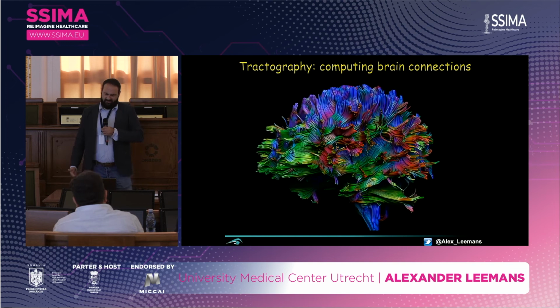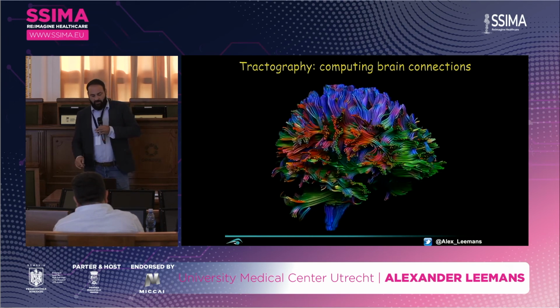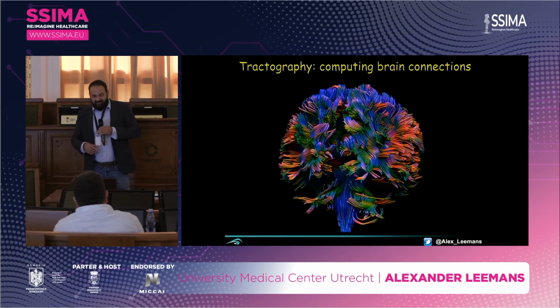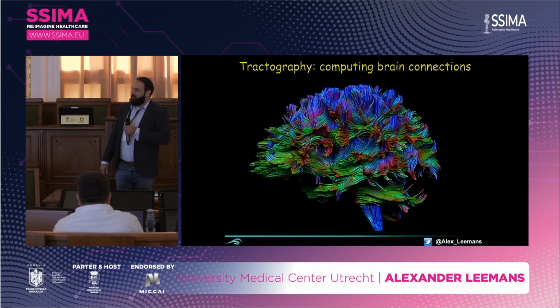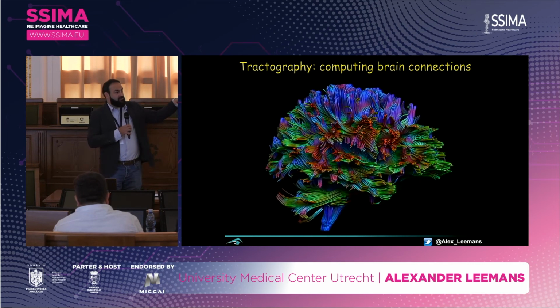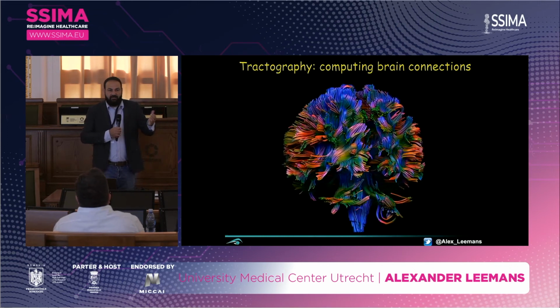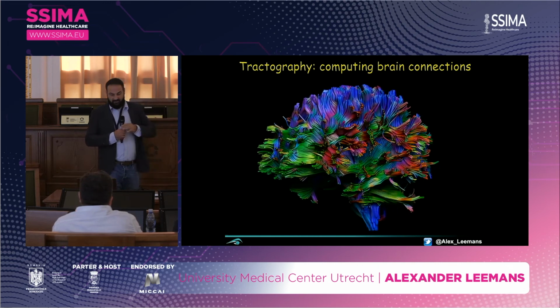And so I was like, "Oh, these are not axons, right?" Oh, okay. So I kind of joked like, "What about the color?" And he said he first wanted to say something like, "Oh, I've never seen a patient with these colors in their brain." Well, duh. This is all CGI, right? I mean, the pathways that we reconstruct, they don't have an actual thickness, right? These are just space curves, right?